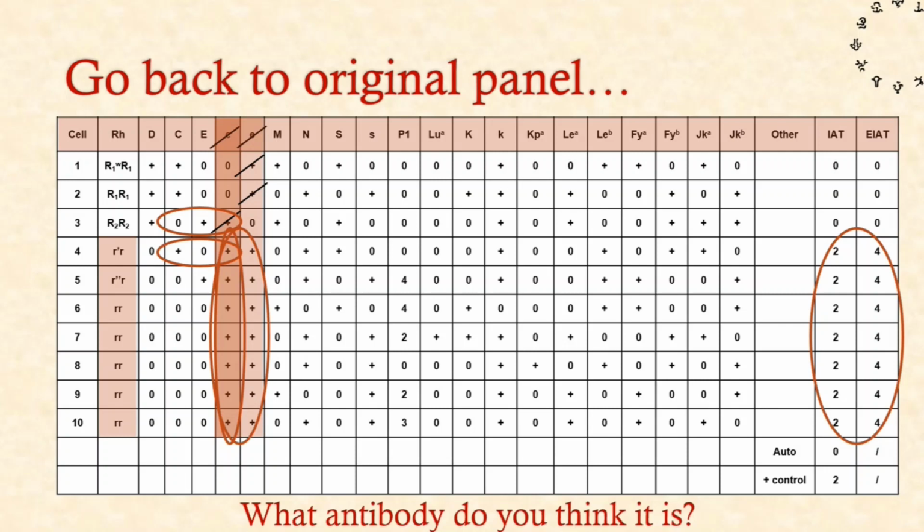But if you look at line 3, that's what you've excluded on. Homozygous little c, negative for big C, and it's negative here. So that's a homozygous. So if it was a weak expression of anti-little c, you would expect this to be positive. This one here is a heterozygous, so that's big C pos, little c pos. And it is positive, but it's the same strength as the rest of them. But the fact that it's hit the hetero but missed the homozygous one just shows that it's not a little c. So you're definitely right. You're just confirming in the back of your mind that you have excluded the presence of little c. It's not just because you've missed a weak expression of it.